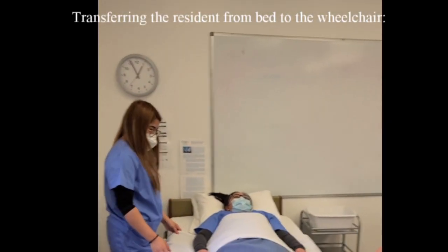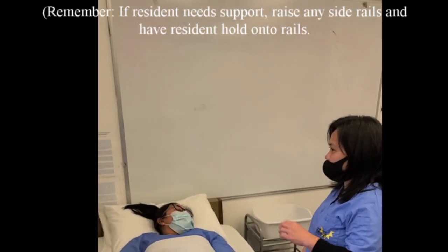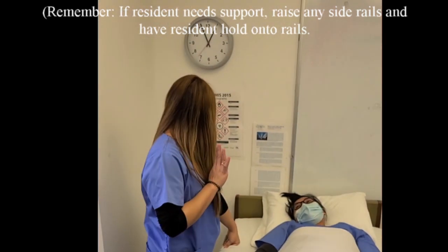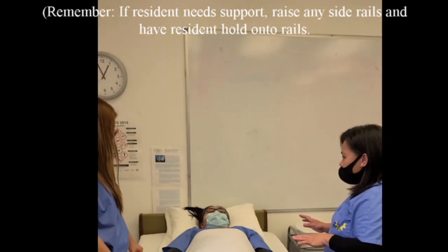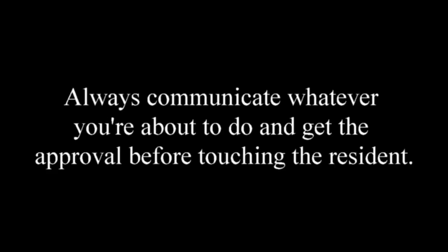Transferring the resident from bed to the wheelchair. Remember, if the resident needs support, raise any side rails and have the resident hold onto the rails. Raise the level of the bed to the highest position before moving the resident onto the sling. This will reduce strain on the caregiver's back. Always communicate whatever you're about to do.